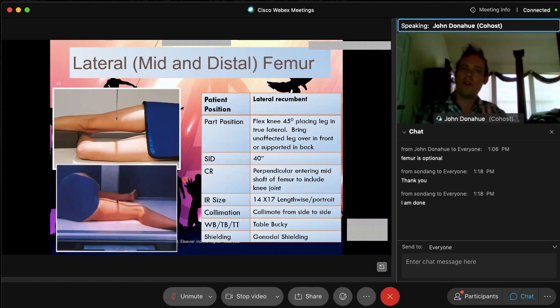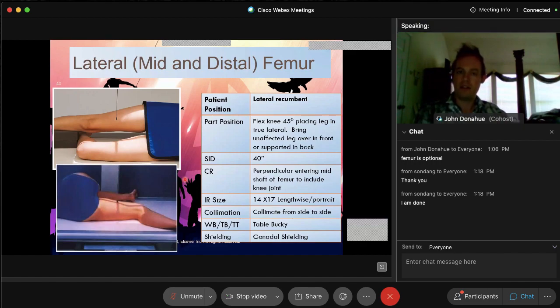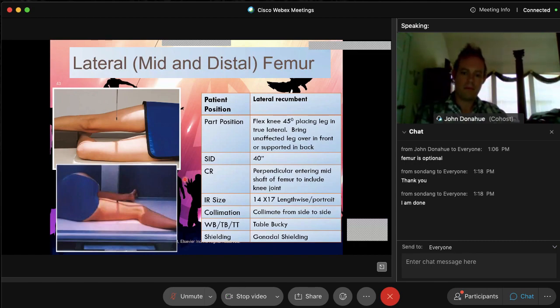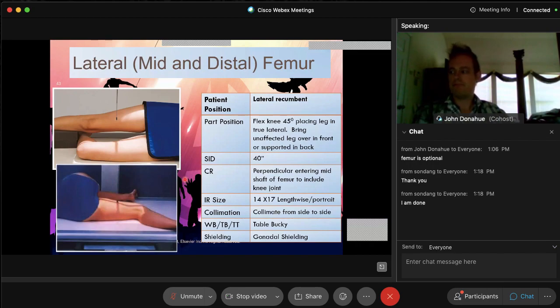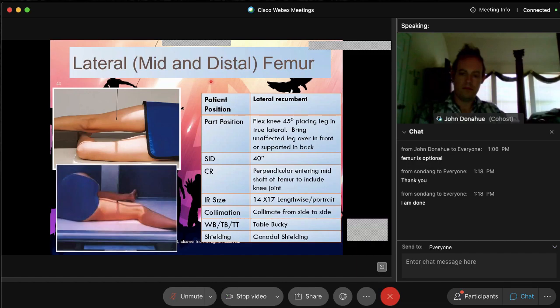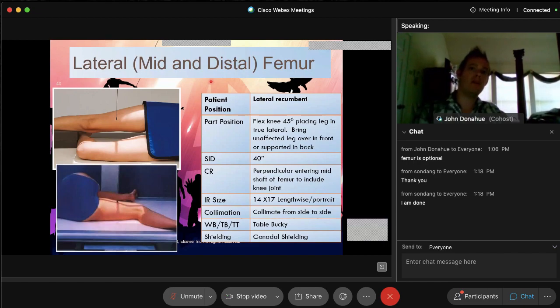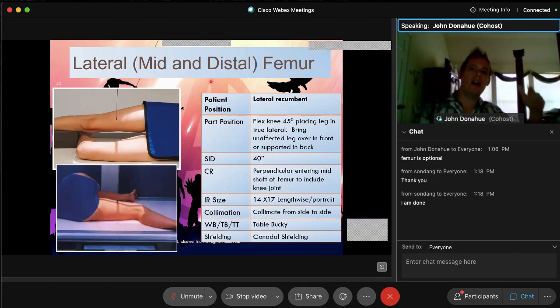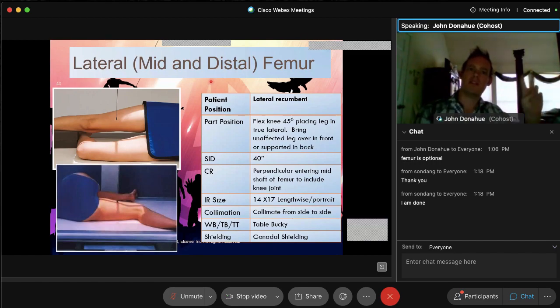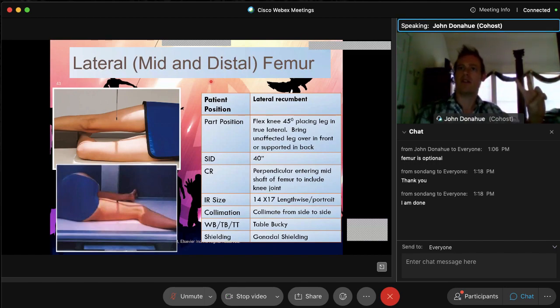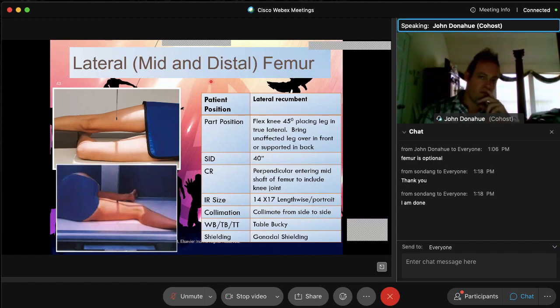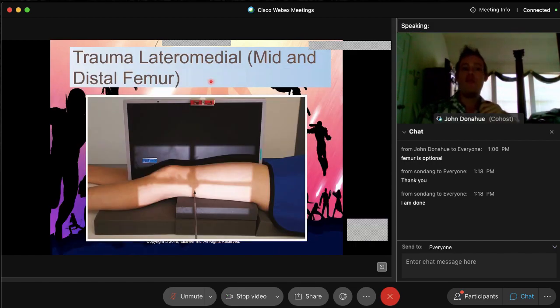This is going to be your lateral distal femur. And do keep in mind in lab, guys, when you actually do your test out, so when it comes to femurs, you're not going to pick just an upper or a lower. If you pick a femur, you're going to be expected to do both the upper and the lower of the AP or the lateral. Just keep in mind.